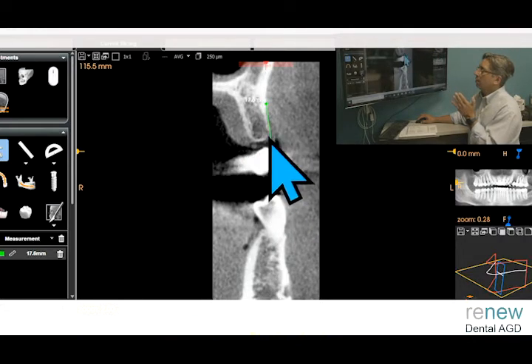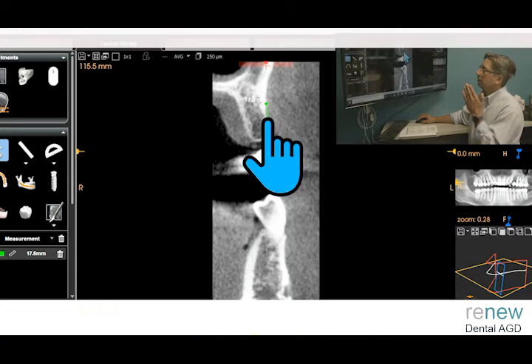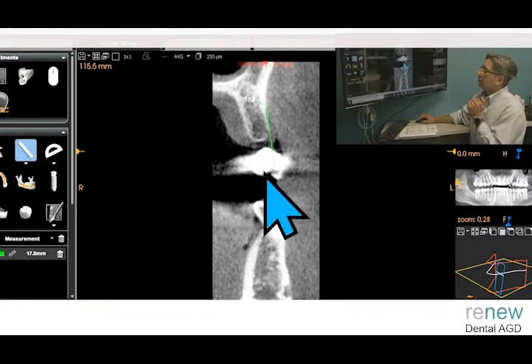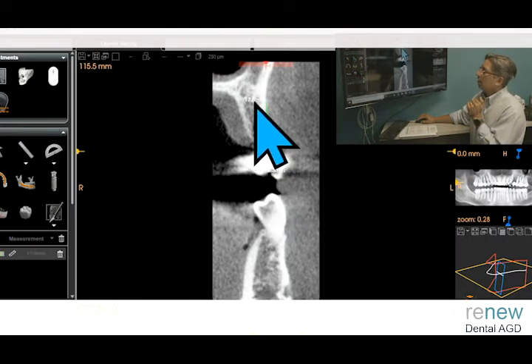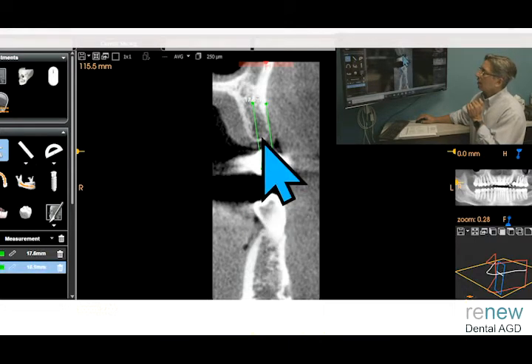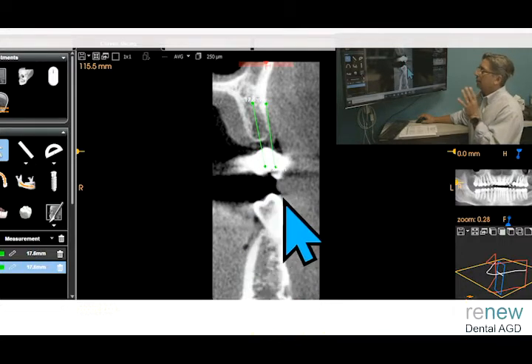You kind of rock it and you feel like, okay, I'm along the bony facial plate here. Now when you do your osteotomy, even if you're going in that angle, that's pretty darn good. Like if you just go parallel to that, you're not going to have a problem. So you're going to try to angle it a little bit away like that. So have a mental note.